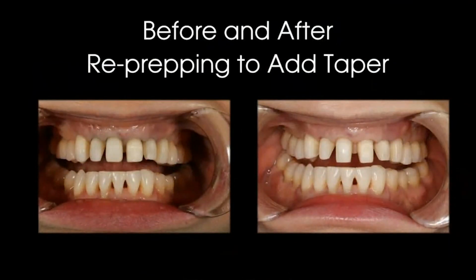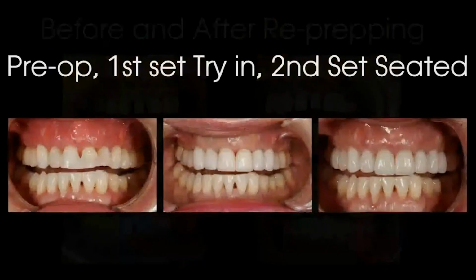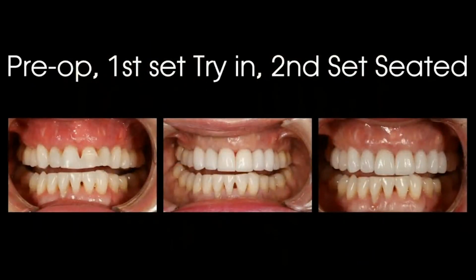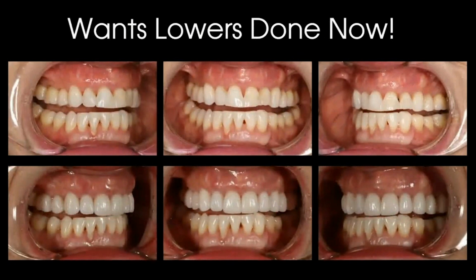So here's after re-prepping to add a bit more taper, before and after re-prepping, and you can see that there's a lot more room to fit something in. So there's the pre-op, the first set try-in, and the second set seated, and you can see there's a big difference in the final result. It turned out to be a great result for what we started with. Her black triangles were all closed, and it turned out really well.